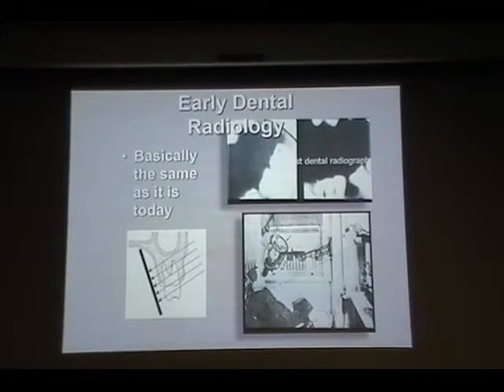Okay. The only thing that has changed from that time to now, like 100 years, is the receptors. The projection geometry, everything else is pretty much the same. So if we take a radiograph and we get noise, the problem could be using low mA, or if the patient is really chubby and you are using low mA, or if there is a defective or faulty receptor.